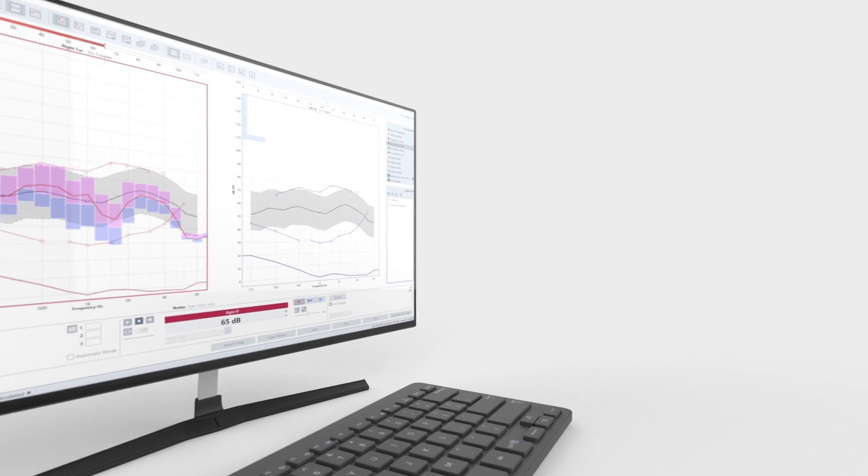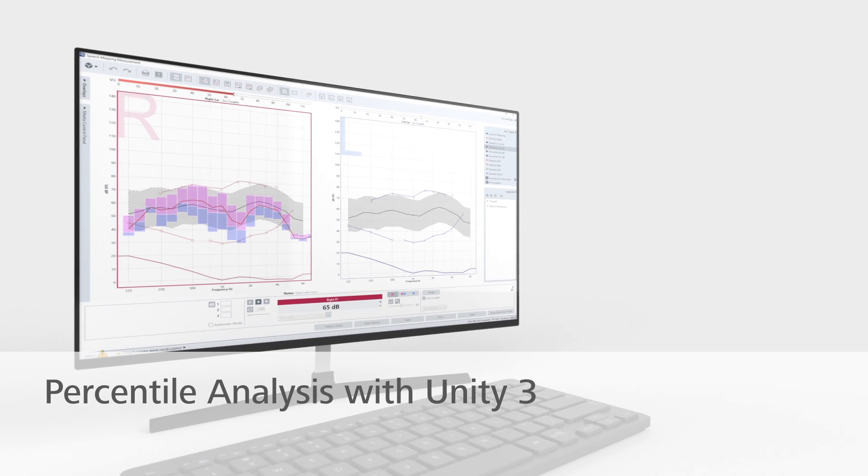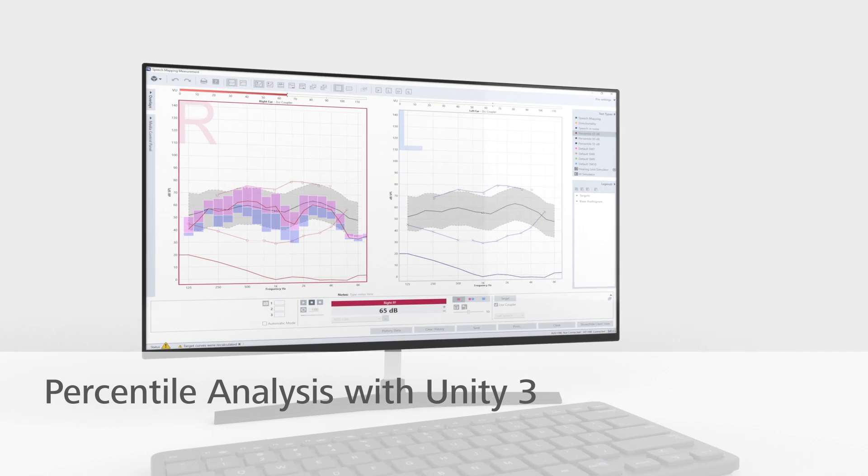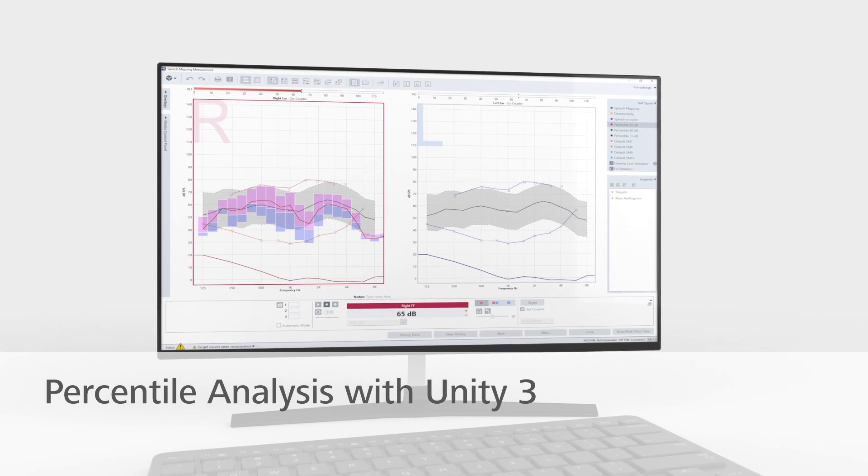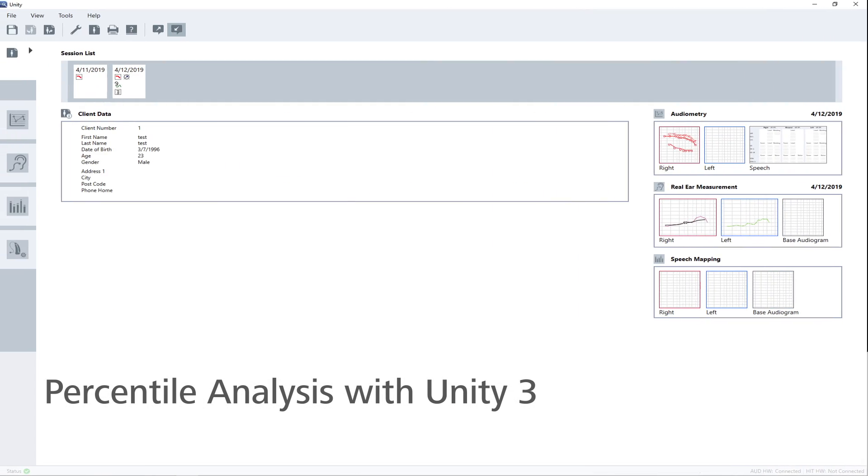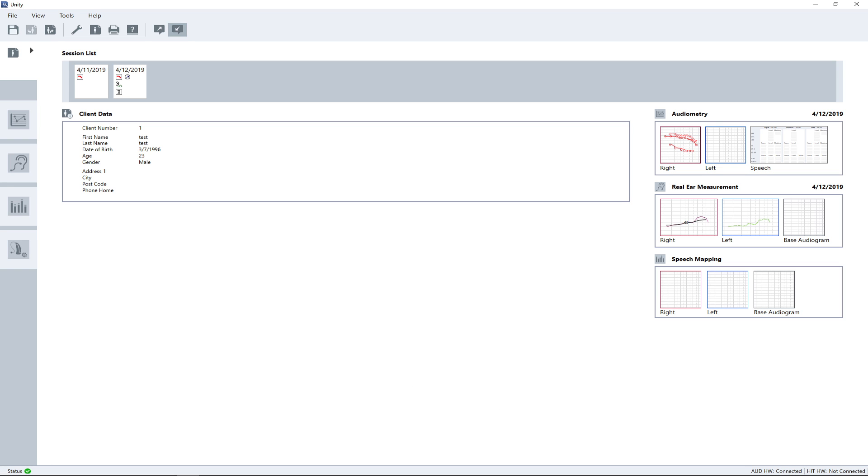This video shows how to run percentile analysis with the Unity 3 measuring system. This measurement requires preconditions such as an audiogram with minimum threshold values of 500, 1000, 2000, and 4000 Hz to be able to calculate a prescription target.